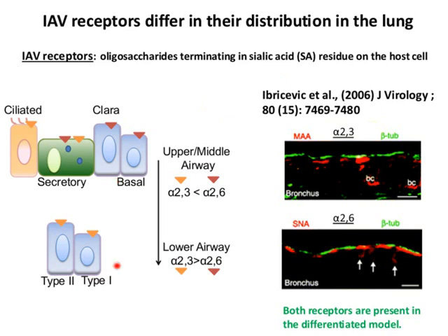receptors become predominantly alpha-2,3. This becomes a very important factor when studying influenza because specific affinity can influence disease severity, which is often associated with lower respiratory pneumonia. The images over here on the right demonstrate both of the receptors are present on the EpiAirway differentiated model.